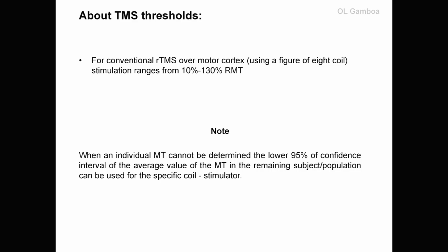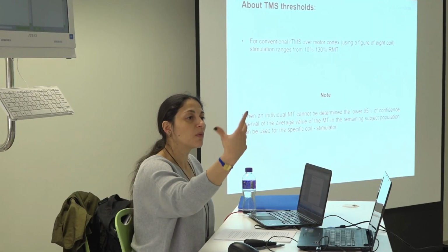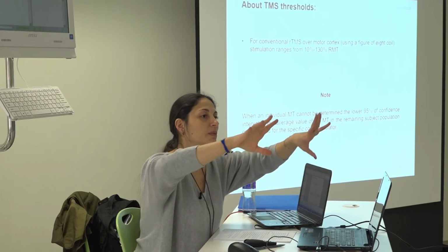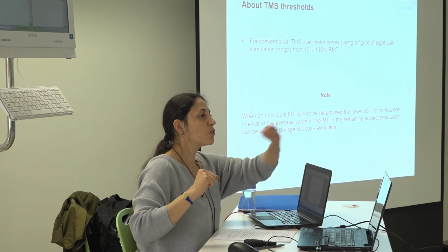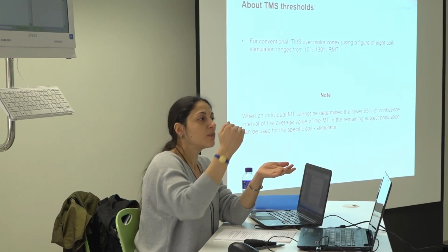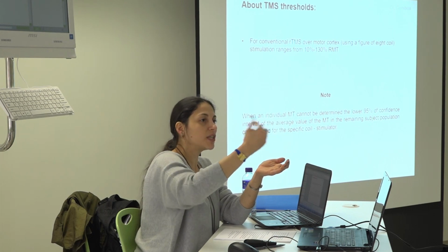But then that is what they are saying. They are saying you cannot determine the motor threshold, so you can find the threshold taking into account the measurements of the population you are measuring. I have this group, you are all participating in my study, and I couldn't find your threshold. So what I will try to use is a value that is common to this group. As I said, in some research you can see studies where everybody is stimulated at 70%, for example, because they have found that 70% is more or less the average. I can get this effect, and then it could be valid.